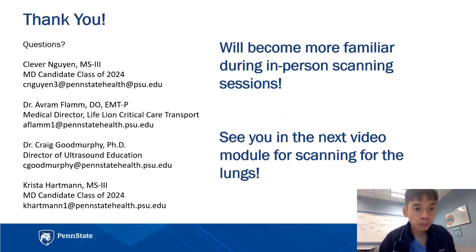So that's the end of this module. If you have any questions, please feel free to email me or email any of our team members here. Hopefully you're able to review this on your own time and take it piece by piece, see what we're talking about when we're talking about a subxiphoid view, aka a pericardial view, aka a subcostal view. See what normal images look like.